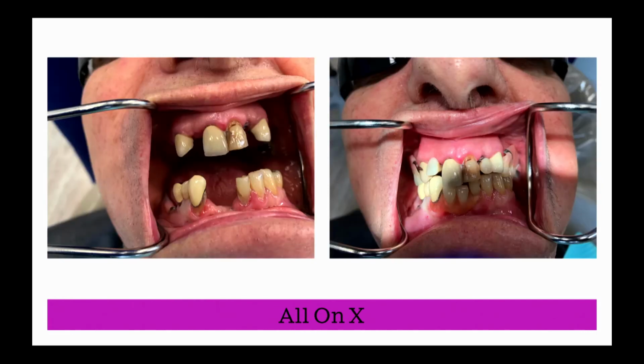So again, 83-year-old patient, this is what he's walking around with. So these are his existing teeth. Not the healthiest guy in the world either at 83, but doing all right. So what we decided to do for him, we have a vertical dimension that he's worked with for 83 years, or at least since he had his permanent teeth. So we decided that we wanted to try and keep him in his temporaries because he didn't want to wear a denture of any kind if he could help it. He was trying to avoid that.